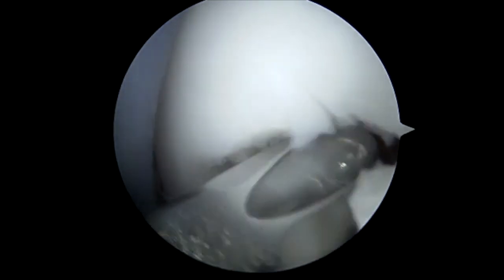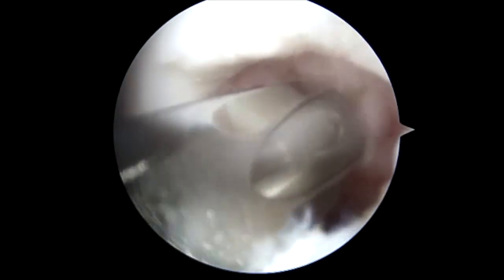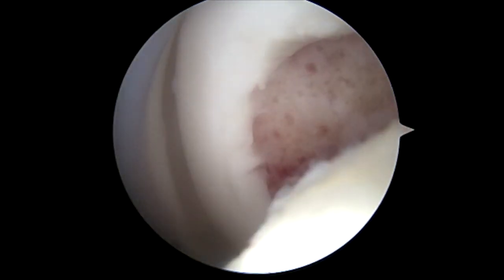You can see here, looking around the corner, the sclerotic area — essentially a non-union at the site. We initially debride with the shaver throughout the rim to allow for excellent circumferential compression.